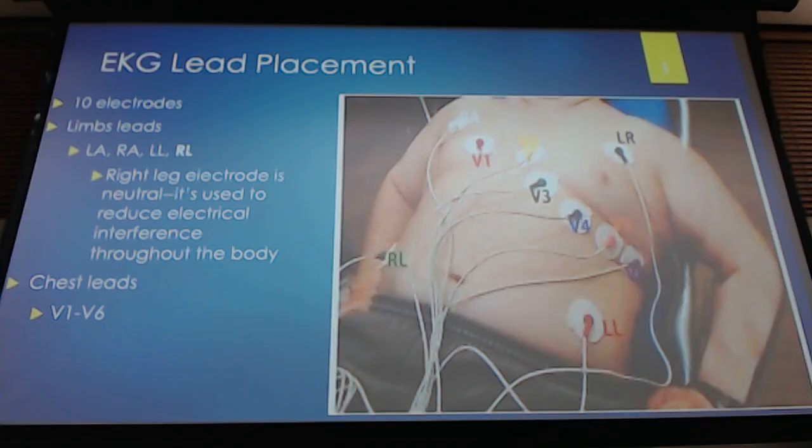And so it's going to be your medics, unfortunately. And you're going to train your medics, and you're going to show them a million times how to do it, and they're going to bring an EKG to you. It looks like the patient is dead, and you're going to say, let's go back to this again and how to hook up these leads.